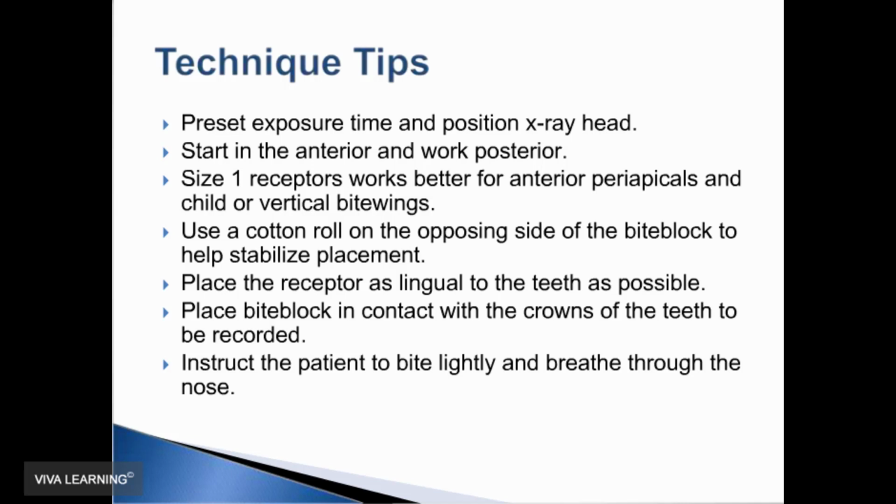I would also recommend using a cotton roll on the opposing side of the bite block to help stabilize the placement. This will reduce the amount of pressure needed to keep the receptor in the proper place and therefore not dig the receptor against the tooth structure.